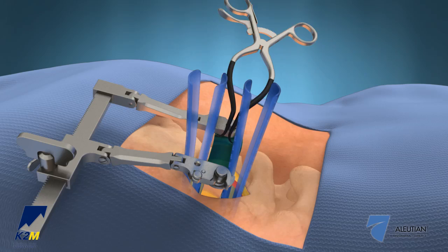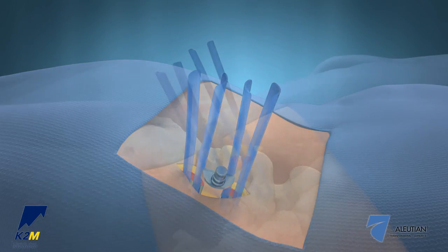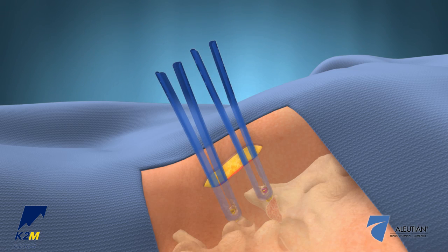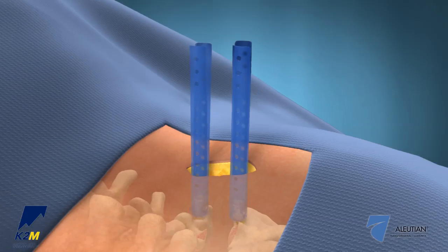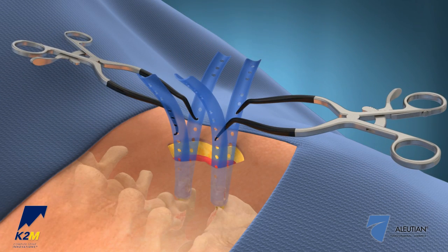Remove the Gelpi retractors and Terra Nova frame assembly. Retrieve the set screws from the screw housings to release the retractor distractor blade. Use the MI head adjuster to realign the screw heads and Serengeti retractors, and then place the Gelpi retractors in the proper position to prepare for rod insertion.